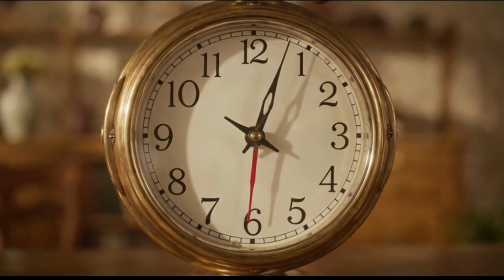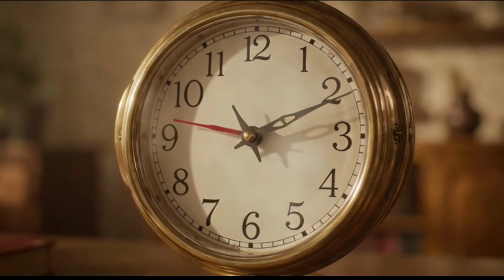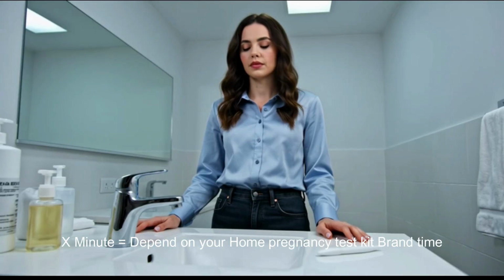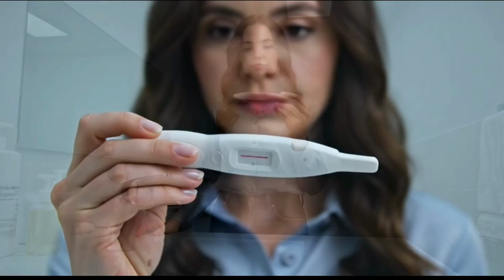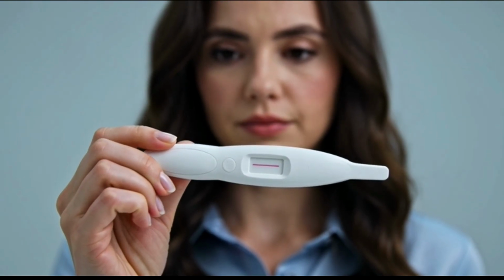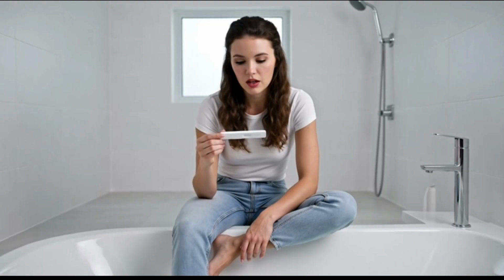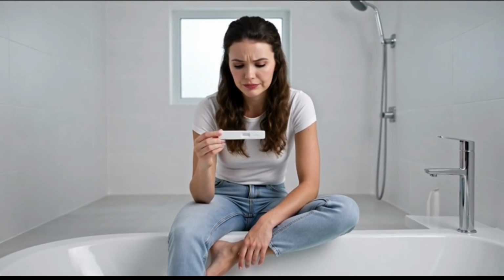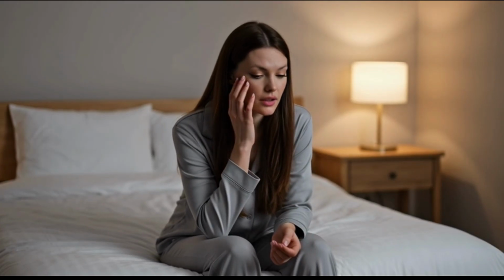Let's talk about timing more carefully. Most tests clearly state, read results within X minutes. That instruction isn't random. After the time window, chemical changes can occur on the strip. This is why doctors say a result read too late should be considered invalid. Many parents feel embarrassed admitting they recheck the test an hour later. Please don't. That is incredibly common. But medically, that second look doesn't give us useful information.